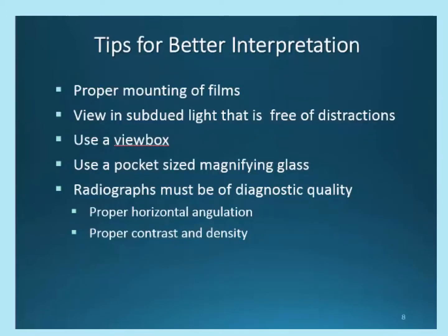From the beginning of this course, you have been required to submit your radiographs and mountings for grading. This has been an exercise to prepare you for interpretation. Proper mounting makes for better interpretation. When the films are mounted for viewing, the distraction of the surrounding light is eliminated, making the process easier. Using a magnifying glass is a common practice when working with film. Digital X-rays can be enlarged for better visibility.